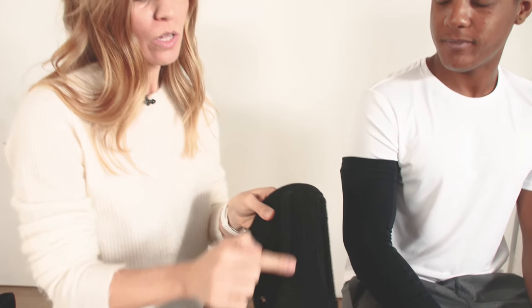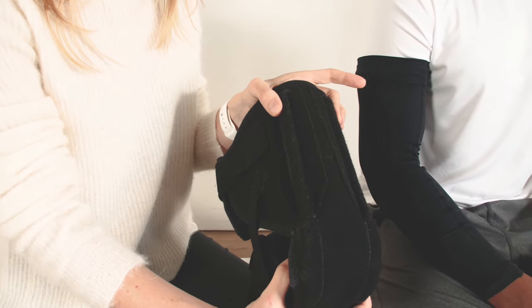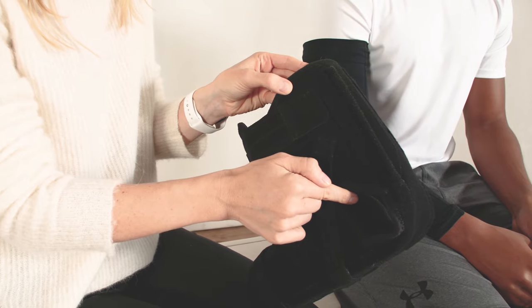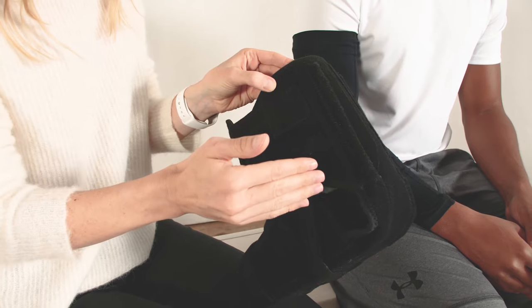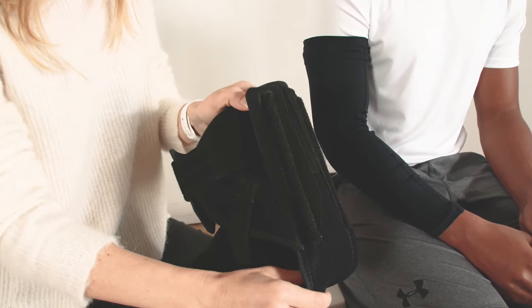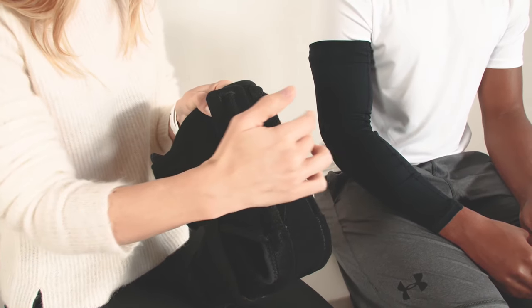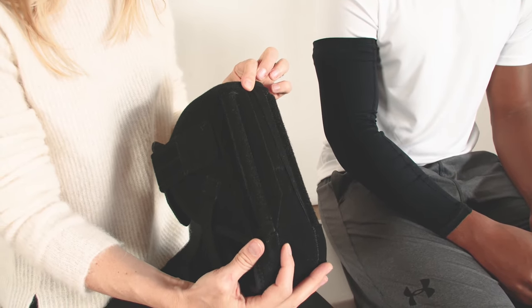Additional features to customize this brace include the dual aluminum rods which create the rigidity and can be bent and adjusted to obtain whatever angle you find necessary for your patient. Additionally, the humeral cuff height can be adjusted so that it fits the patient appropriately and isn't too far into the armpit or too low on the humerus. You simply detach the rod pockets like this and then pull the cuff up to lengthen it or push it down to shorten it. Once you have both of these loosened, reapply the rod cuffs in place and you're all set for sizing.